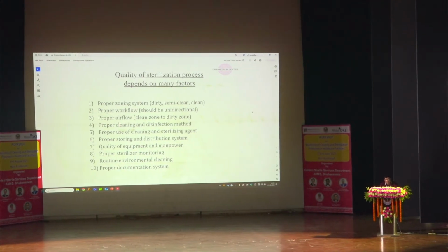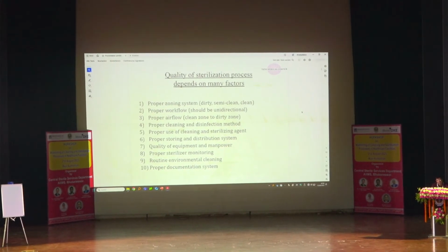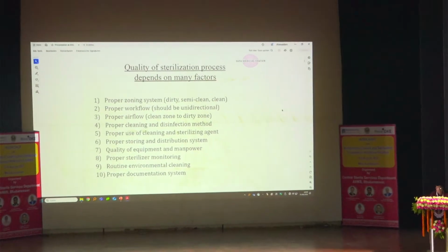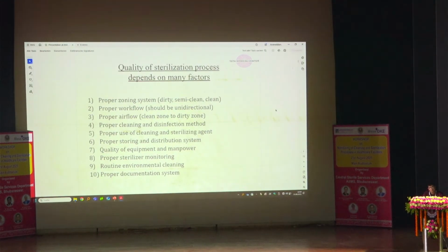Other departments thought that only cleaning, disinfection and sterilization is for the CSSD, it is not. If you provide the standard materials, you have to maintain all these factors.